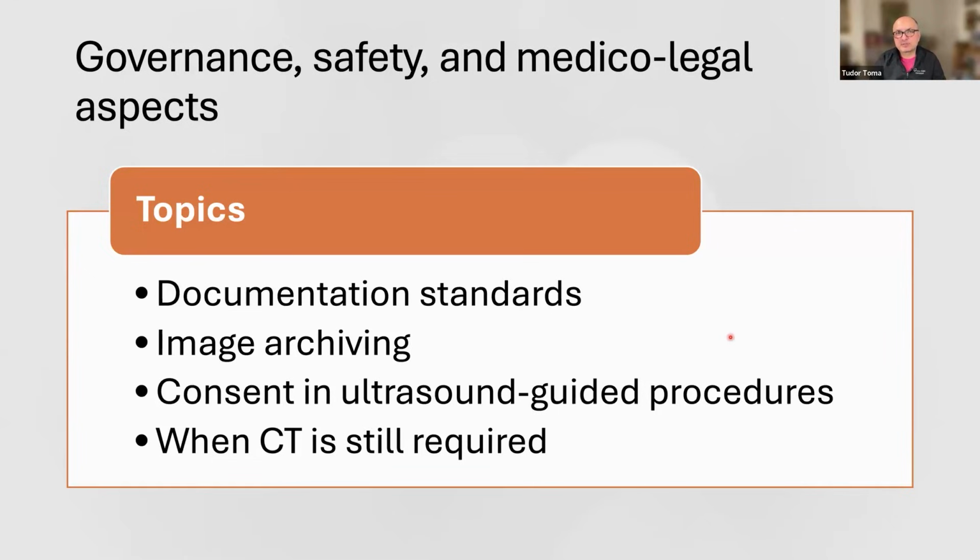And it's also important not to forget that sometimes CT is required in these patients, and it's very easy to become extremely enthusiastic, maybe as I am, on thoracic ultrasound, and deny the fact that some patients do actually need a CT. One example I'll give you is for patients with pneumothoraces which are difficult to drain. You would still need a CT, which gives you a panoramic view of the structure of the lung, where the pathology is, where the problems still are. So I think that's important.